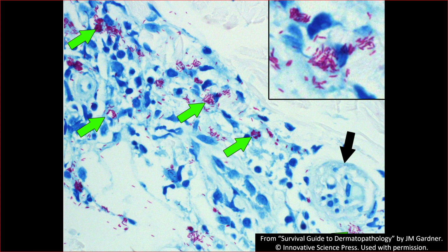That's the other classification scheme you can use, paucibacillary and multibacillary, which I kind of like because I think it's a little more simple. The lepromatous form has tons and tons of organisms, as opposed to the tuberculoid form, which is usually pauci. Paucibacillary has few organisms.